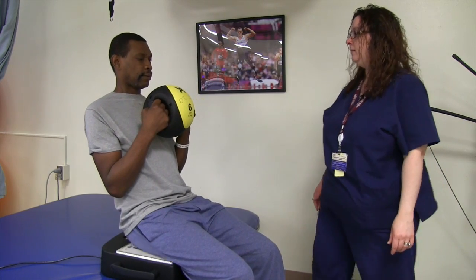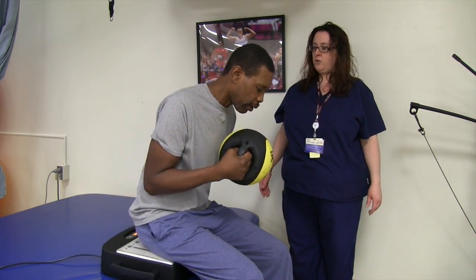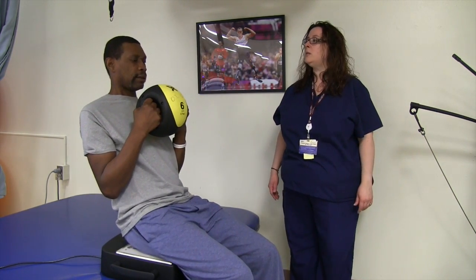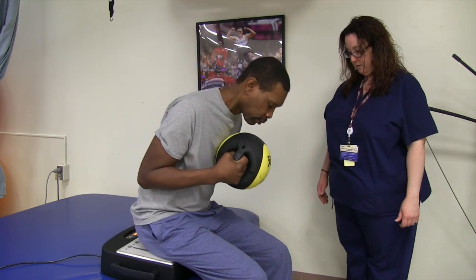Go back — there you go — and forward. Nice, nice, nice — control that. That's good, that's good. Slowly though, nice and controlled. Make sure feet stay planted on the floor.